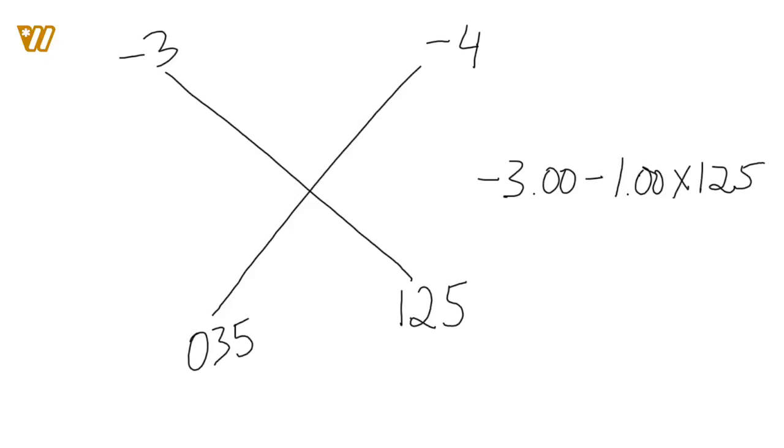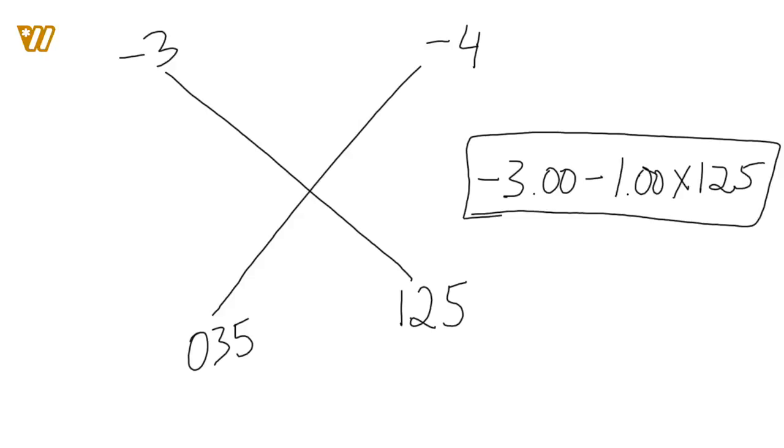For me, I'm always going to put things on a power cross. We had -3 at axis 125. We rotate the dial 90 degrees, and now we get a -4 as our absolute power. So when we write this in minus cylinder prescription form, we're going to have -3, -1, axis 125.